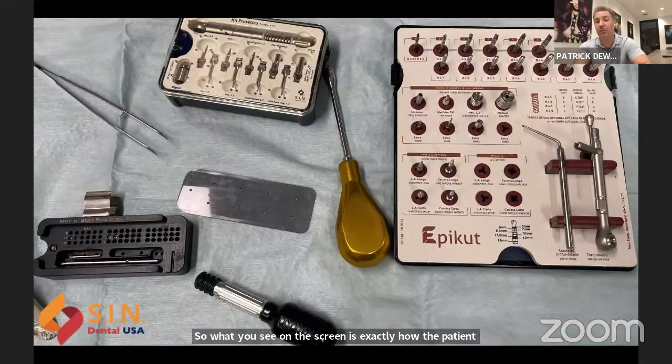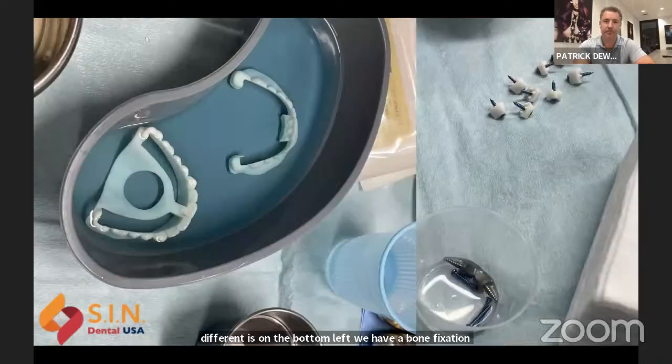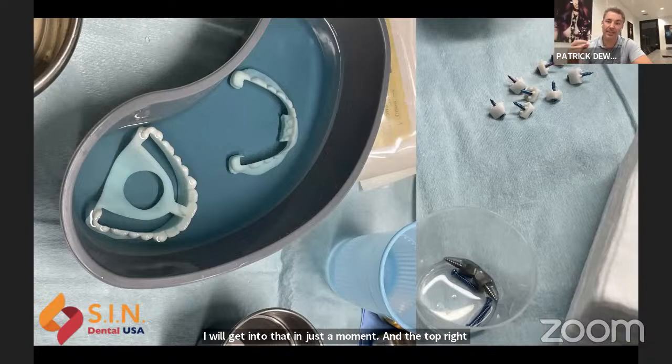What's unique is when you go to the surgical situation and sit down to actually do surgery, the first thing you notice that's different is on the bottom left, we have a bone fixation screw kit. I will get into that in just a moment. The top right are the bone fixation screws, and you'll see a white sleeve that is 3D printed that we have a design of, and we'll put them around these bone fixation screws. These are very, very critical because these are what we use to relate the post-op scans to the pre-op bite. That way we have a reference to the proper vertical.